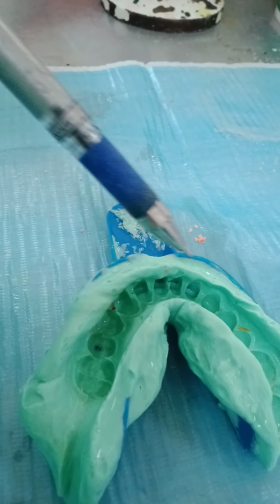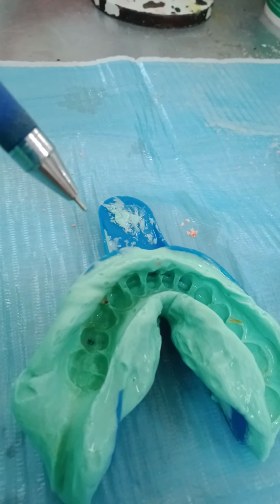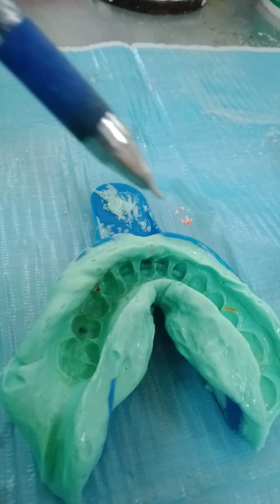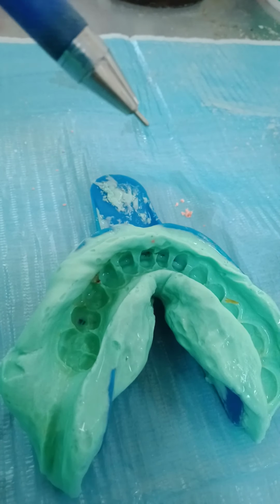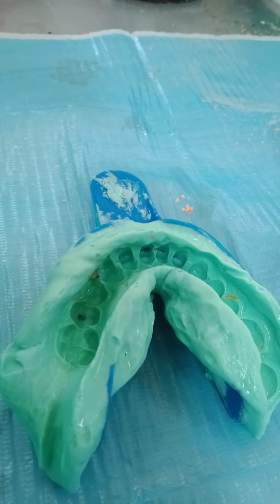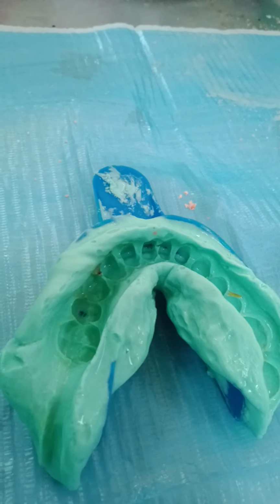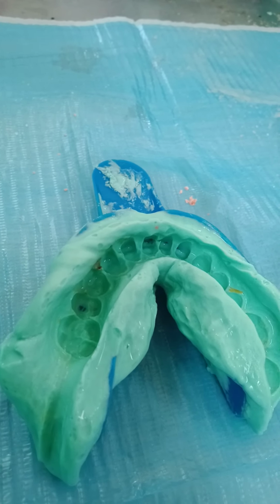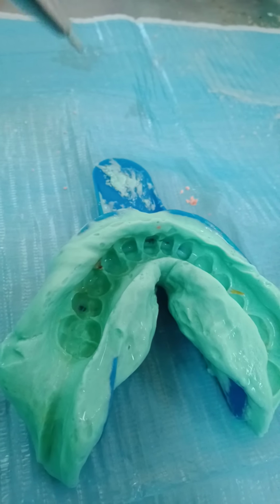The second thing is the lip trap. Do you see this lip trap? Why does this happen? Because you didn't stretch the lip before. But many times I tell students, you have a lip trap, and they say, I stretched the lip. Why did this happen? Because they stretched the lip after loading the tray and seating it vertically on the teeth. We stretch the lip before seating.